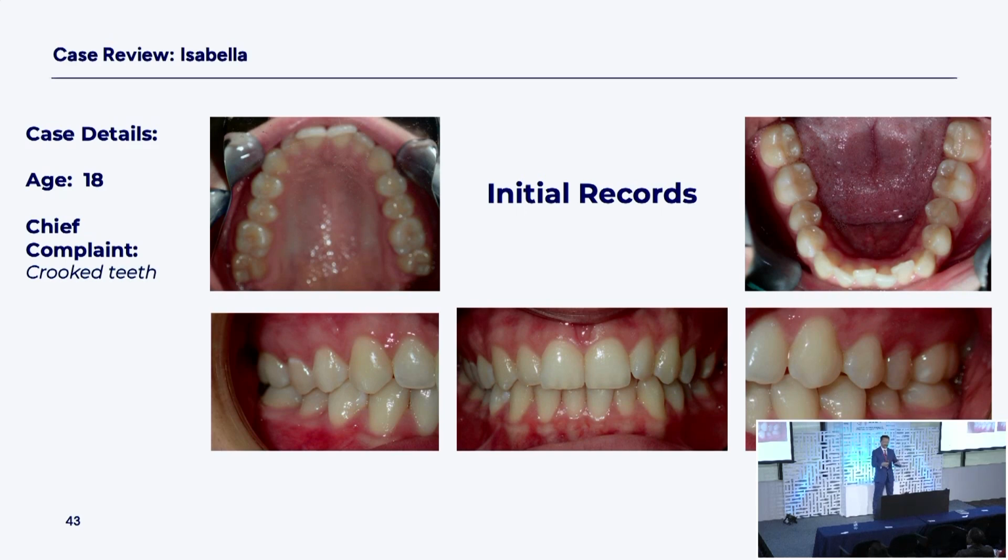Take a look at the back teeth, all collapsed in. In the center photograph of the anterior bite, look at the lower posterior teeth collapsed into shadows and the upper angled in. You have full collapse of the posterior teeth here, and you have a mild amount of crowding. The lower occlusal view is crystal clear how the back teeth are leaning in. Even tooth number 20 is leaning in and rotated pretty far. So we know we're going to work on arch form with an inclination, and when we do all that uprighting, this is going to be beautiful.